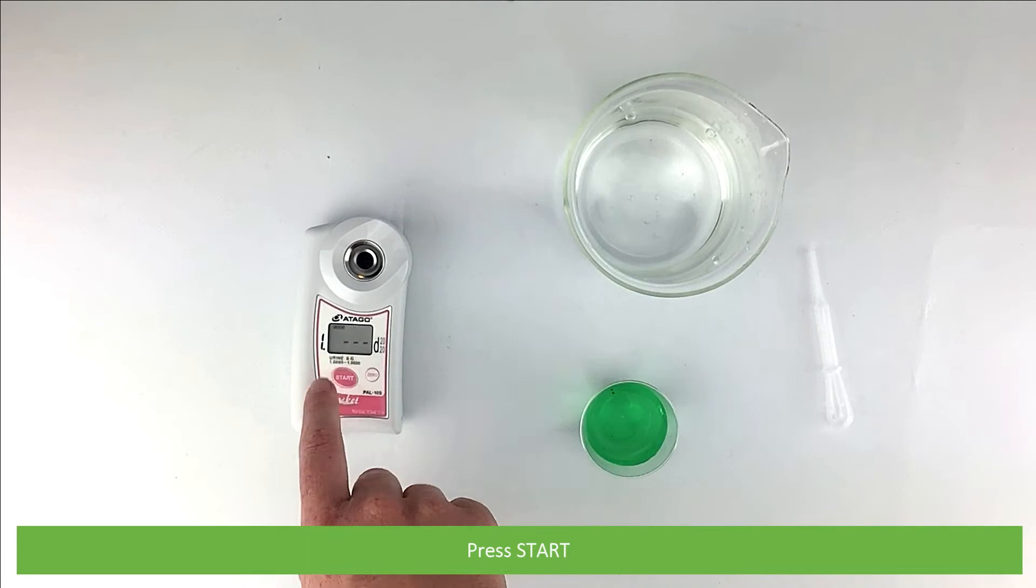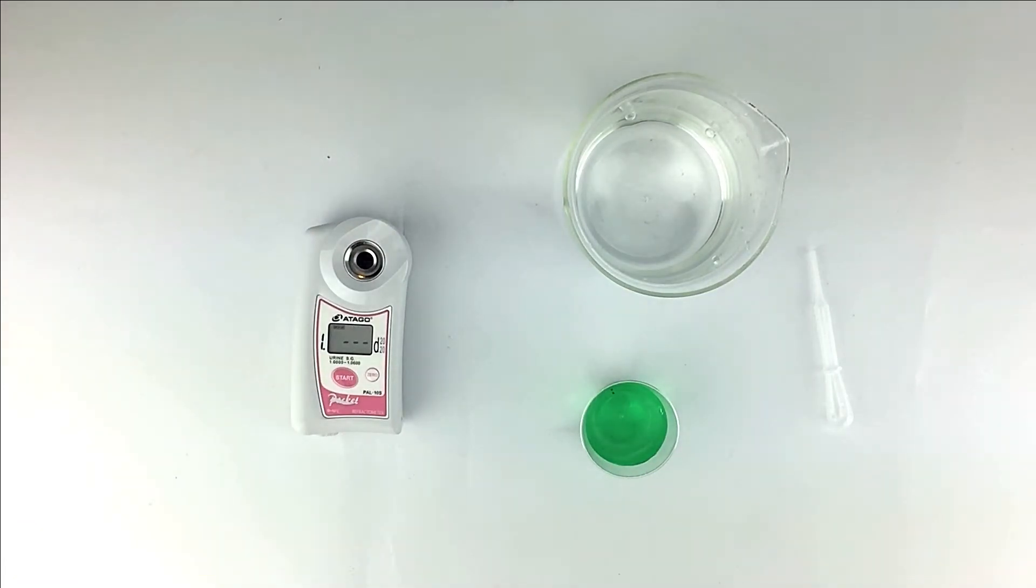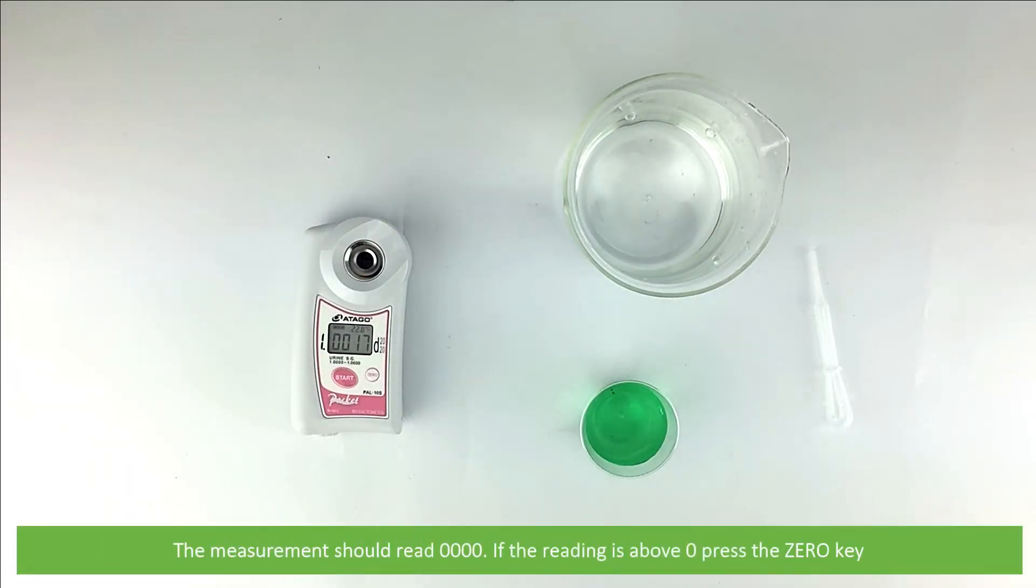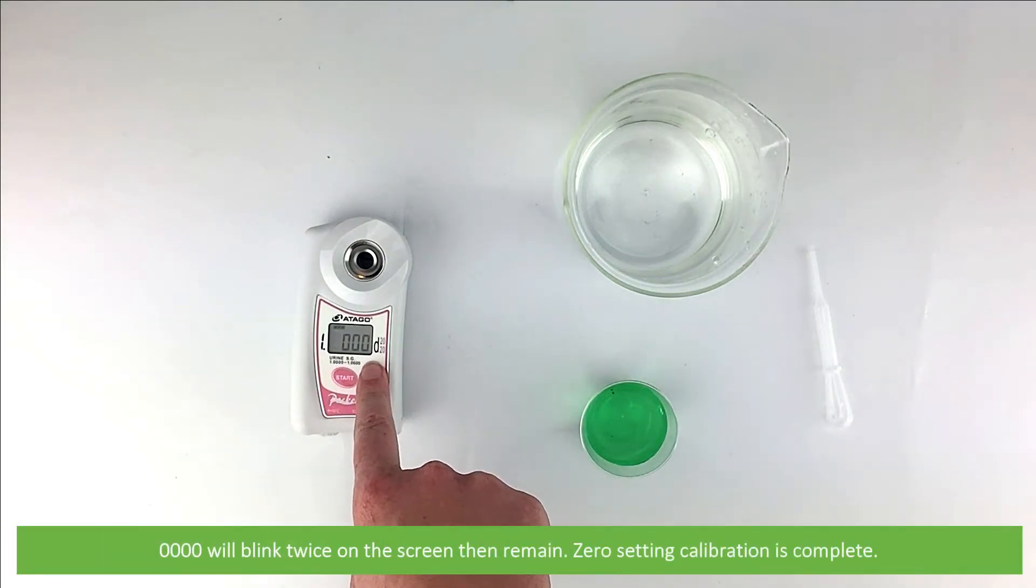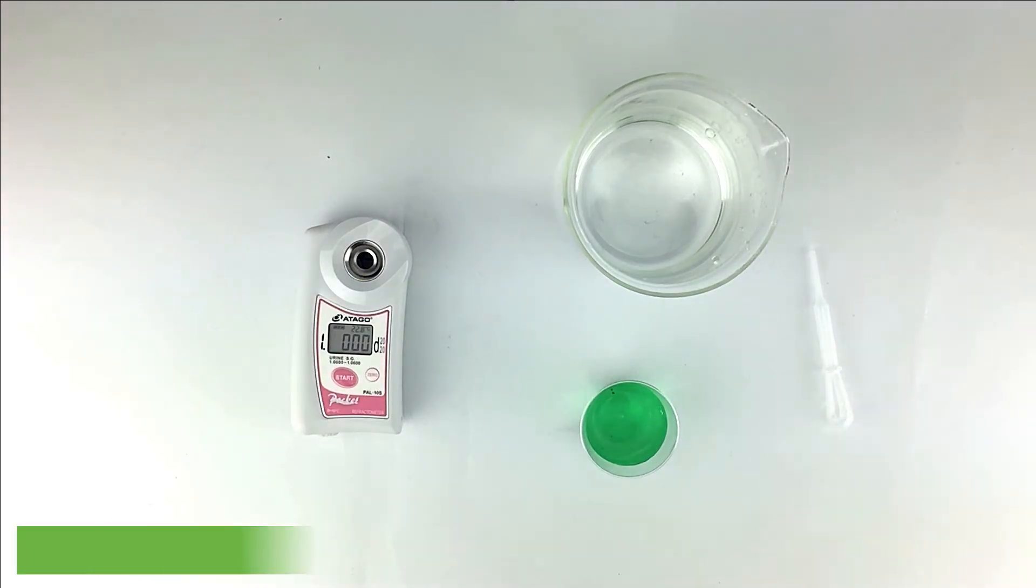Press Start. The measurement should read quadruple zero. If the reading is above quadruple zero, press the zero key. Four zeros will blink twice on the screen, then remain. The zero setting calibration is complete. Wipe the prism clean.